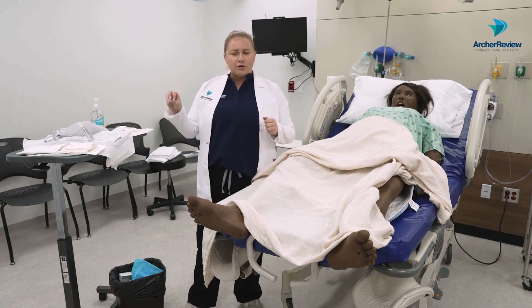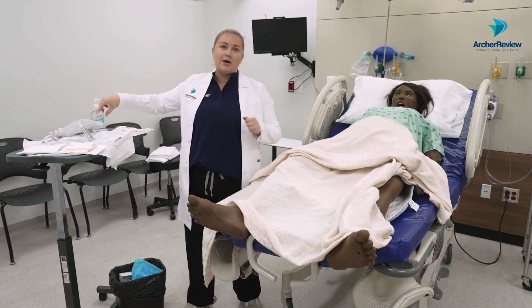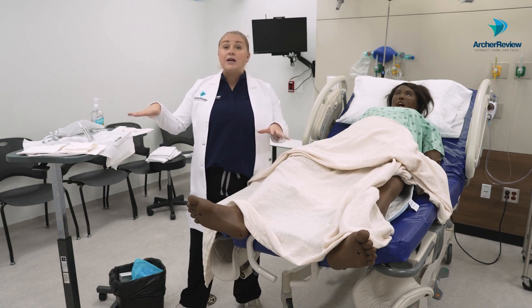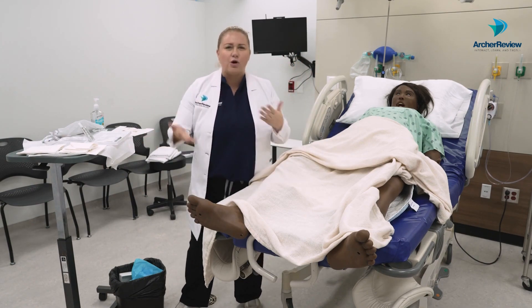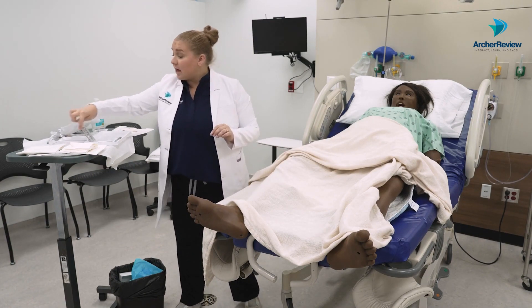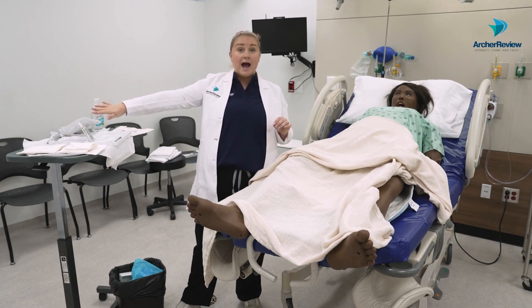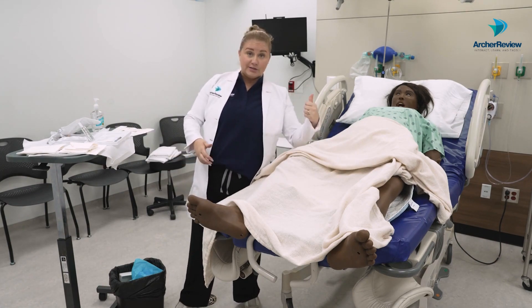In the tray, first and foremost, you're going to have your catheter hooked up to a drainage collection bag. What we have set up in our sterile field I would never touch with my hands — I just want to show you what we're working with. The standard drainage collection bag is right here, hooked up to our catheter, and it comes in a nice little plastic container because we're trying to keep it absolutely as sterile as possible. We're not opening it until we're sterile and ready to insert.